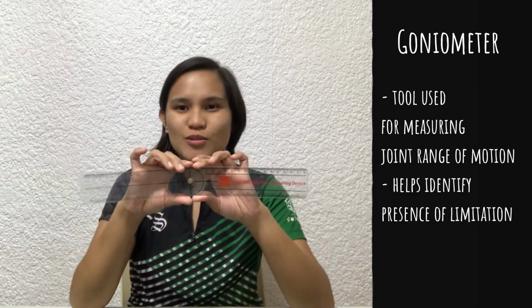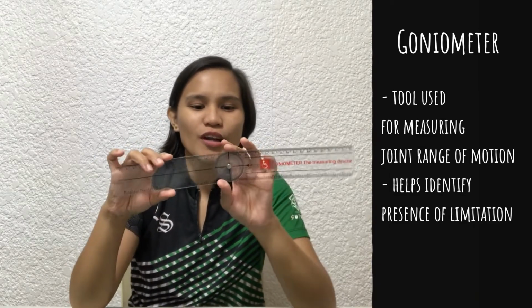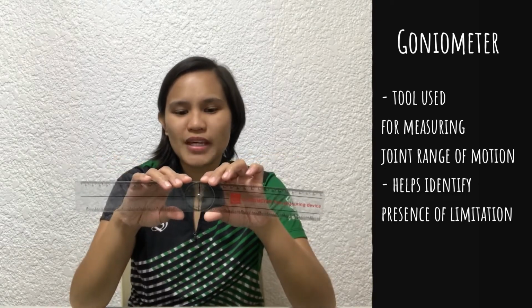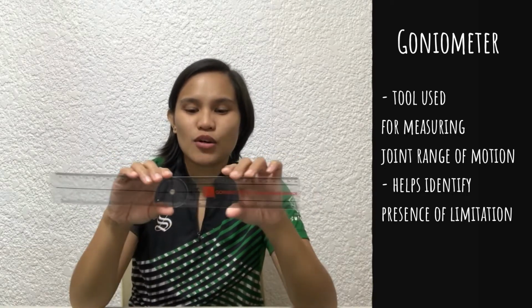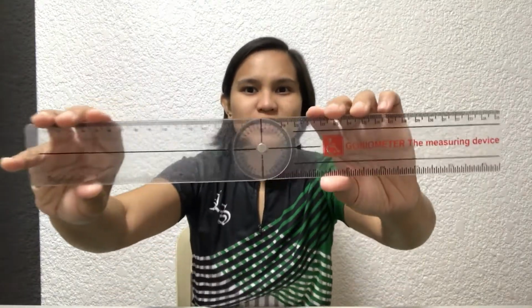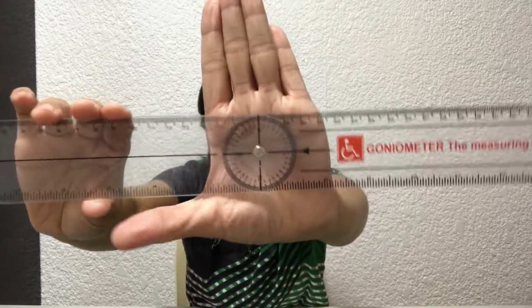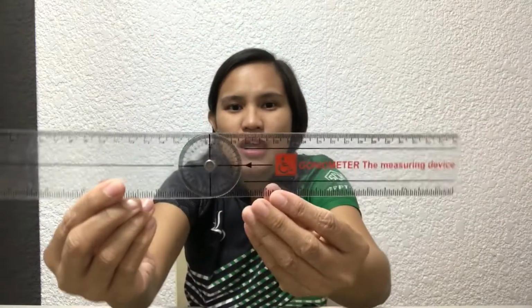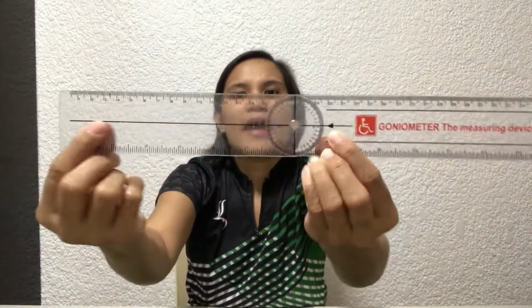Hello everyone! So this time I'm going to demonstrate to you how to use the goniometer. The goniometer is a tool that we use to measure the range of motion of a specific joint in the body so that we can know if there are any limitations of motion that we have to address from the patient. Just to be more specific, as you can see, the goniometer has numbers on the circles like a protractor, and it has an arrow here and a line here.